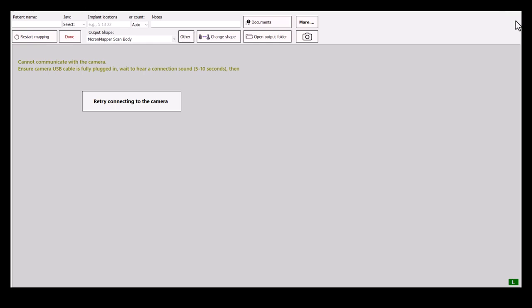Hello, and welcome to another video of MicronMapper Tips and Tricks. Today, I will show you how to properly import additional scan bodies to the software.